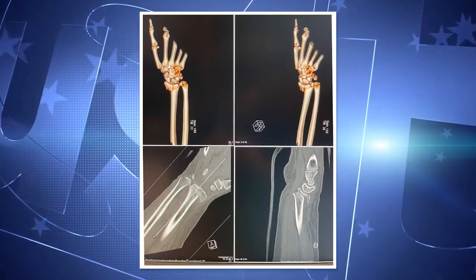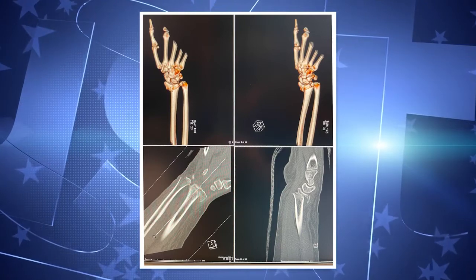Well, it's fascinating, Jeff, to see the power of that tool and how dynamic it is to get those deep images and how helpful that can be in your work. For the patient, on the patient side, what is the experience like and what can they expect getting a CT?